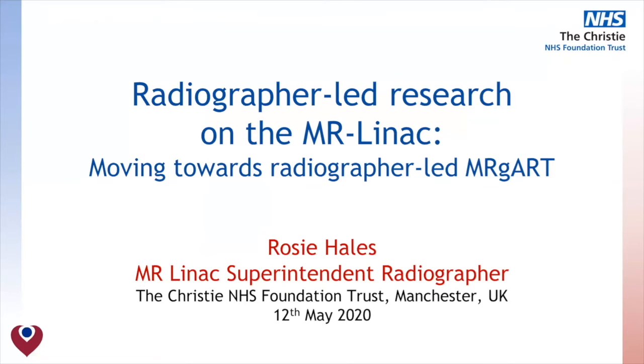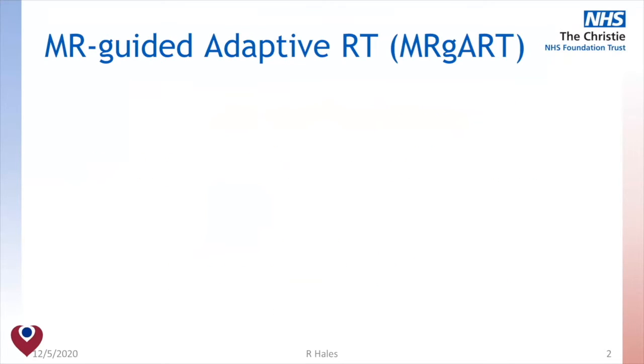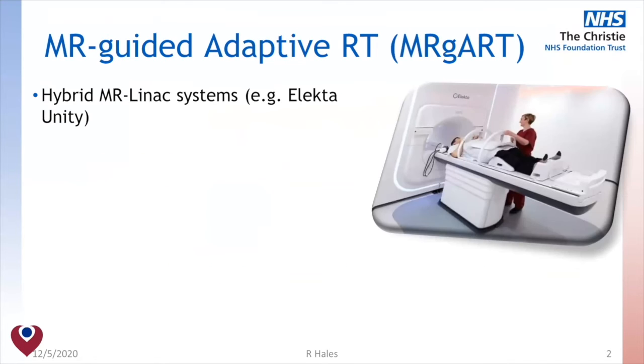Yep. Okay, so as Cynthia said, I'm Rosie Hales, and I'm just going to talk about treatments on the MR-Linac and how radiographer-led research is helping to increase efficiency in our treatment delivery. For those of you who might not be aware, MR-Linacs are hybrid systems which combine an MR scanner with a linear accelerator, and the Elekta Unity is the MR-Linac that we have installed here at the Christie.